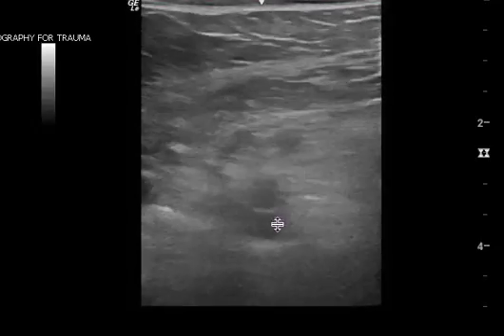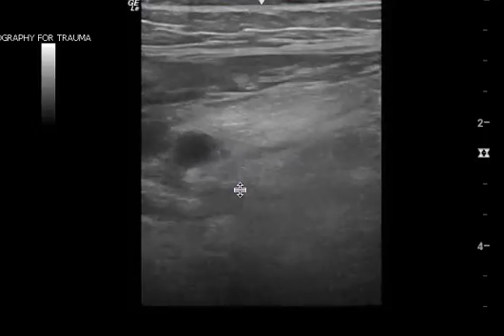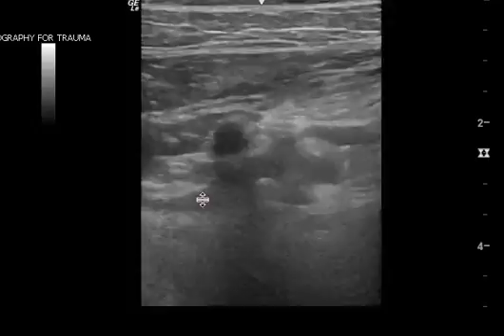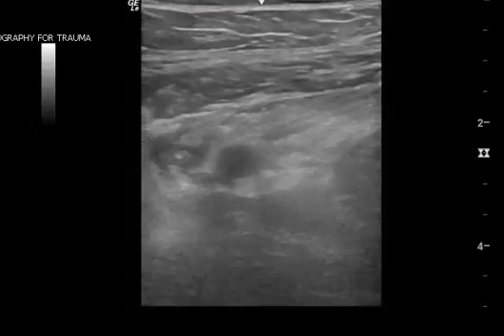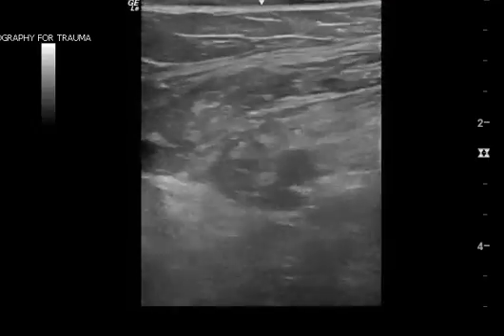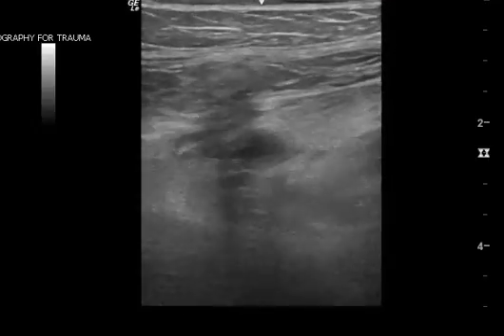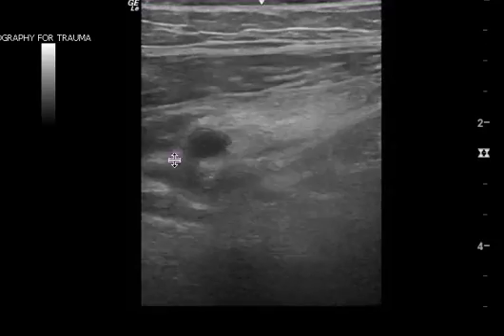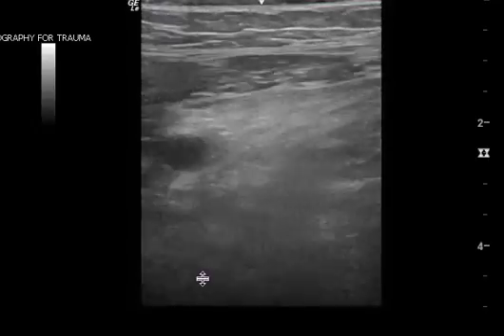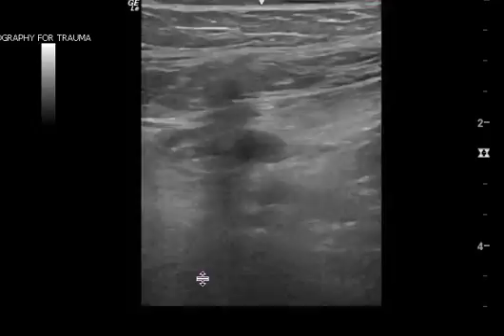The common femoral collapses completely, as does the popliteal and the distal femoral, but I am worried that what I'm seeing over here may be a saphenous vein clot. When you're compressing, there is a portion right over here that doesn't compress, and that's why I'm wondering if that is indeed a greater saphenous clot.